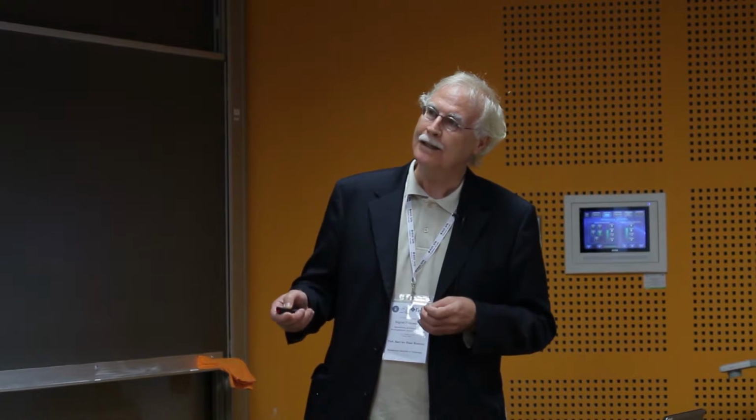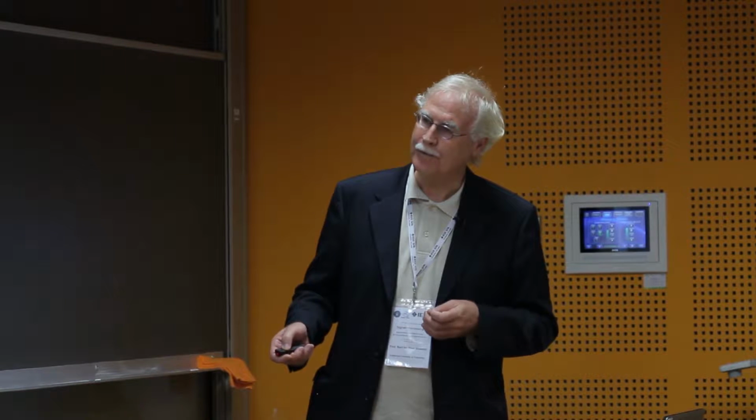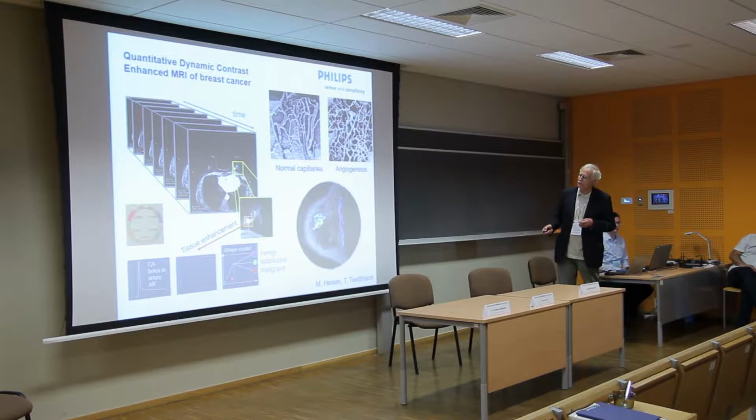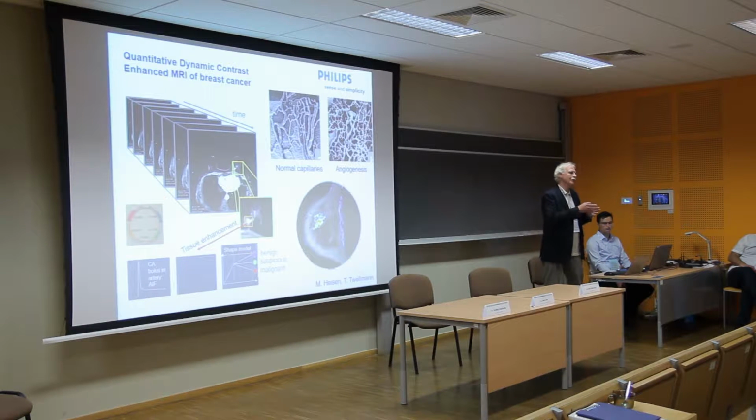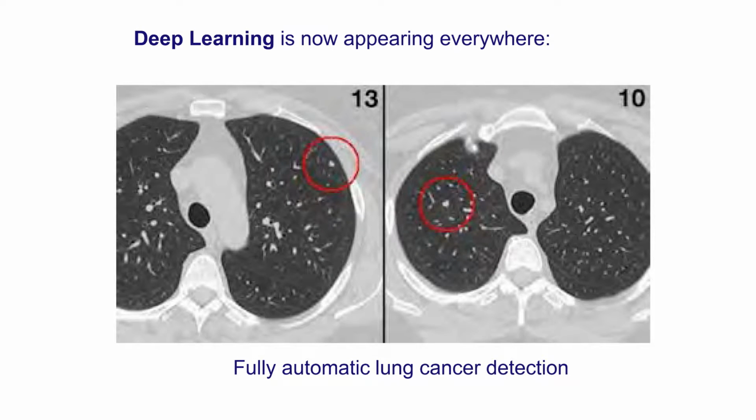So in the tumor, you have different blood vessels, and you can see them by measuring a time series and then measuring the flow. And here we have the uptake of the contrast medium over time. If it is a really fast washout, it's malignant. If it's very slow, it's benign. So you can mark now the pixels. For every pixel you can see how fast it was actually flowing away. And then what you do is you mark all this.